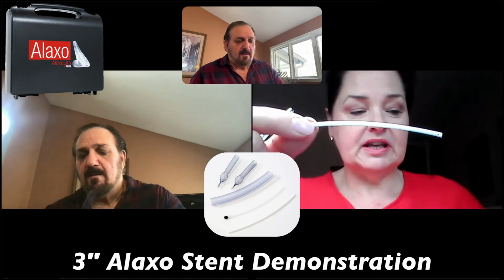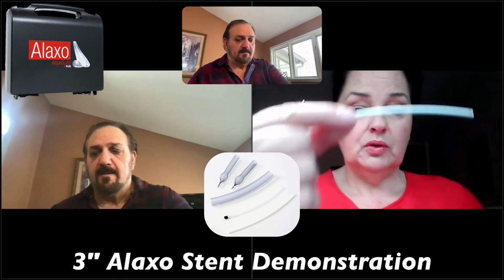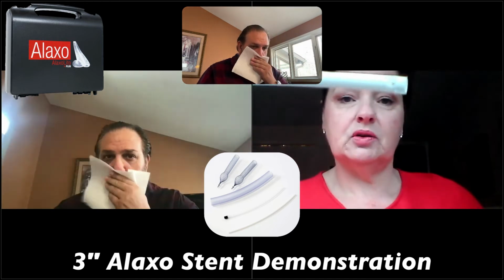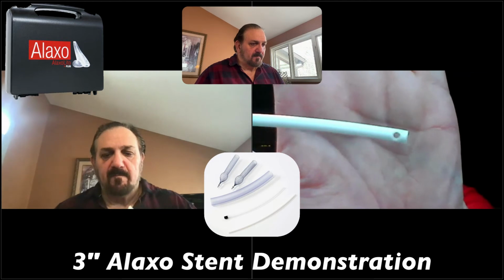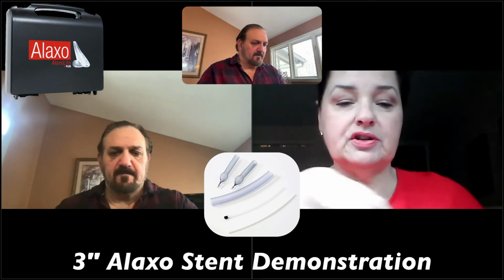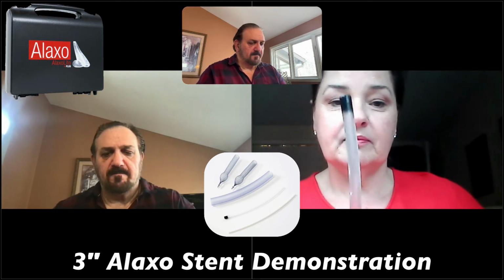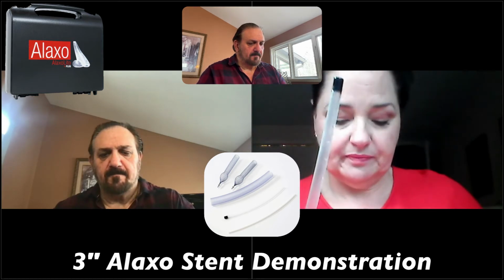Okay. But for the sake of your recording, you have 3 pieces that we're working with. You have the pusher rod, which is the little white rod that's bent, and it has the little opening, the hole. That's the pusher rod. You have the introduction tube, which is the clear little tube with the black tip, and that's the tube that goes over top of the pusher rod.